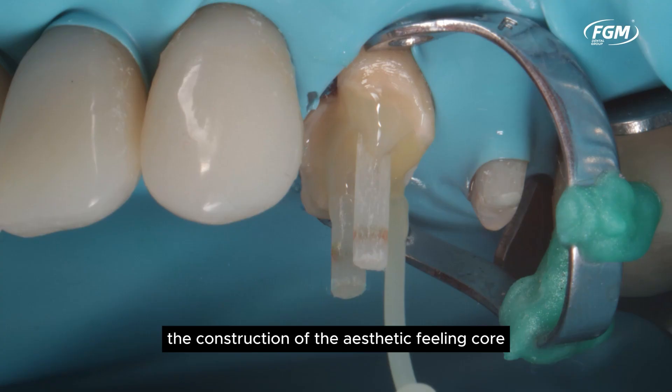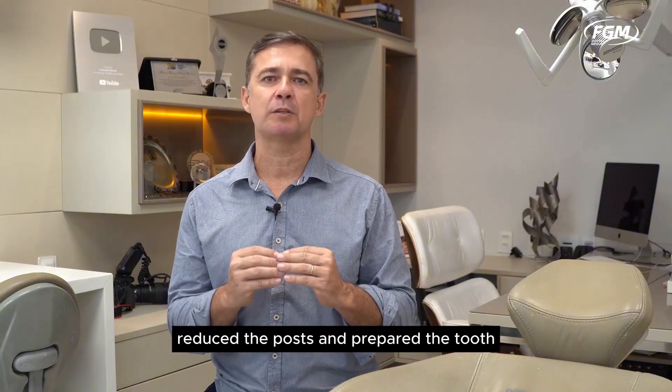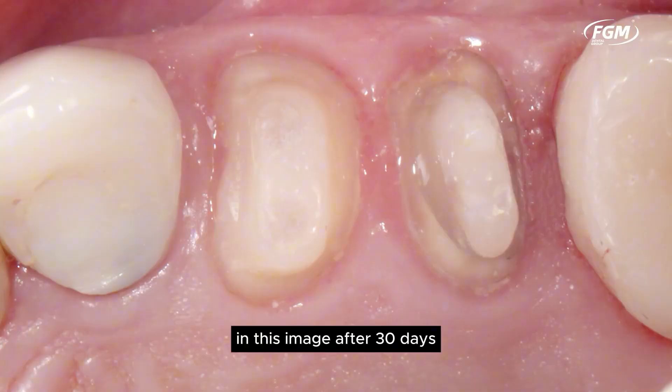The construction of the aesthetic filling core was performed with AlcemCore cement, which has adequate resistance for this purpose. After photopolymerization, we waited 10 minutes, reduced the posts, and prepared the tooth, proceeding to the fabrication of provisionals. In this image, after 30 days, we have an occlusal view of the teeth prepared for resin crowns.